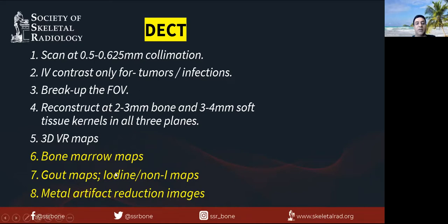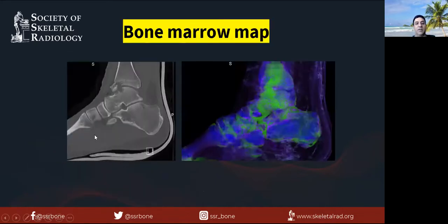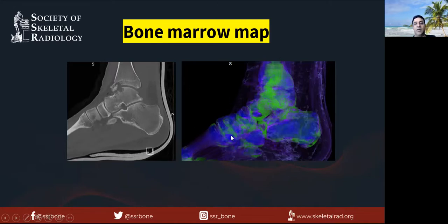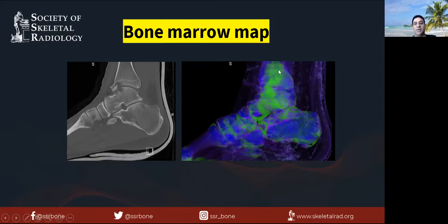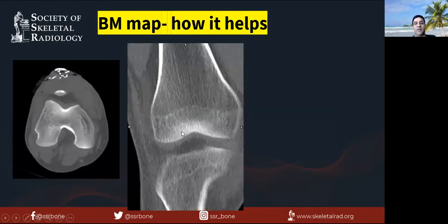Bone marrow maps are similar to MRI — they show bone edema as green colors on a translucent blue 3D map that can be rotated. Normal bones appear blue. Green at the edges are edge attenuation artifacts. This helps identify the area of real edema, which is where the fracture is — helping find fractures, increasing confidence, and quickly identifying non-displaced fractures when you're imaging a whole extremity on call.